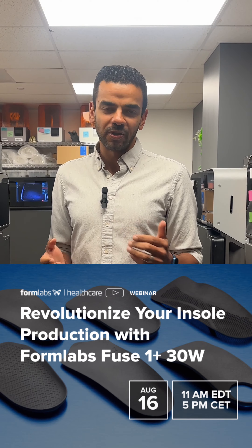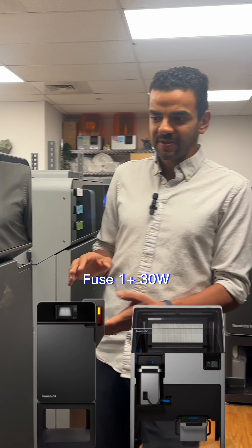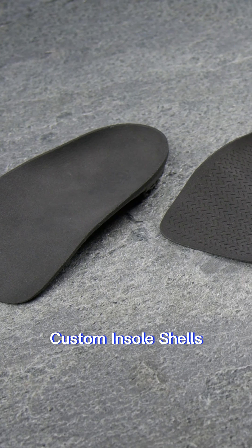At the webinar, you can learn how to use the Formlabs Fuse One Plus 3D printers — just like these — to create custom insole shells.